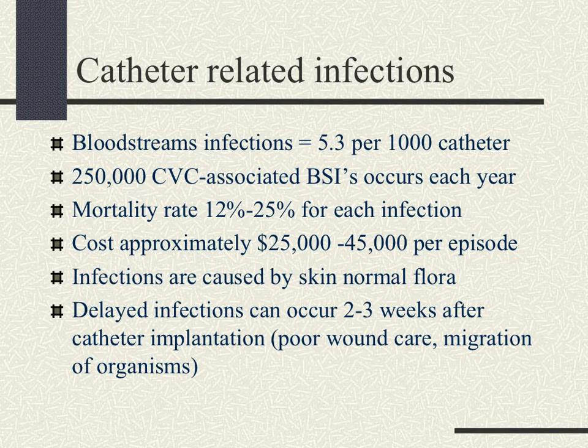Infections are caused by skin normal flora. And what happens is there's a delayed infection that can occur 2 to 3 weeks after the catheter implantation related to poor wound care and migration of those organisms, or those normal organisms on the skin.